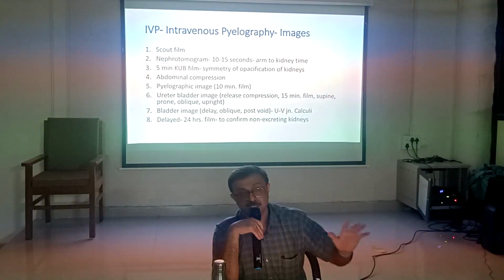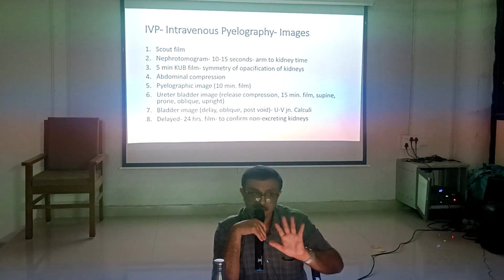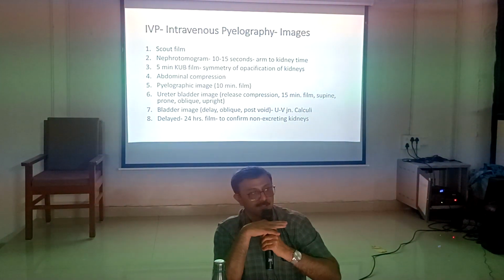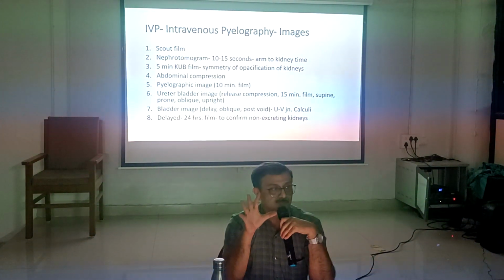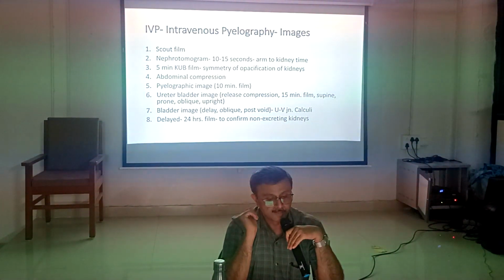Diagnosis is real time. This is a real-time procedure. Now the patient is passing urine, they are seeing, they are observing, and they are reporting. Sometimes we cannot diagnose by plates only.